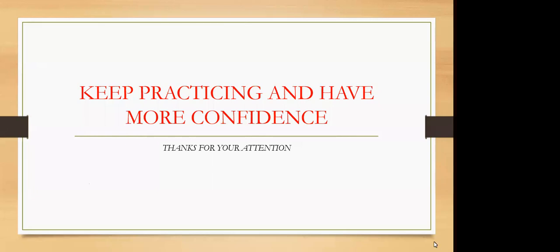Don't allow them to give you a vague area, the whole iliac fossa. No. Tell them, where is it? Is it in one place? Is it all over the whole region? Because most of the time, if a person has appendicitis, it's going to be in one place, and you point with a finger to that place. So you just put a probe and search in that place.